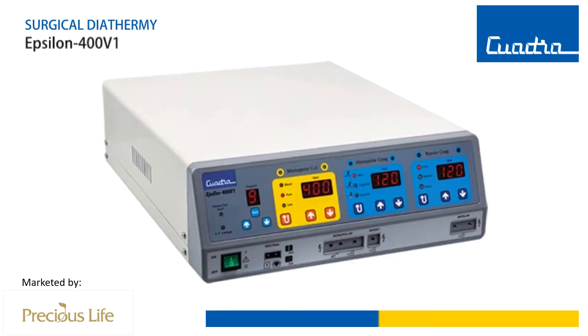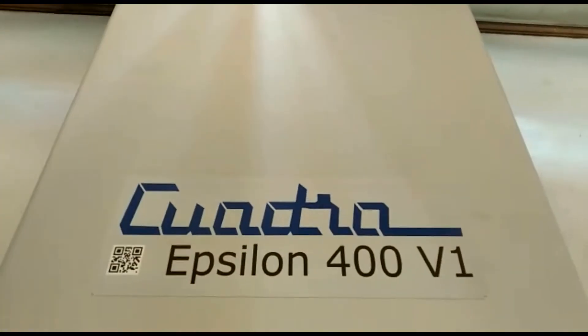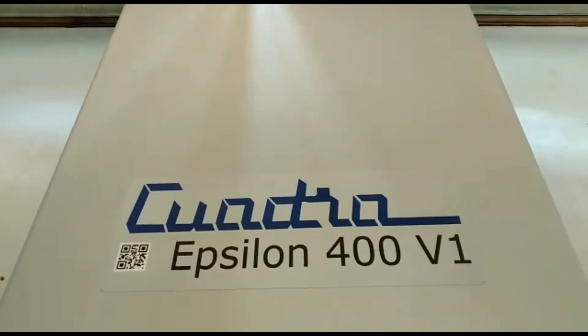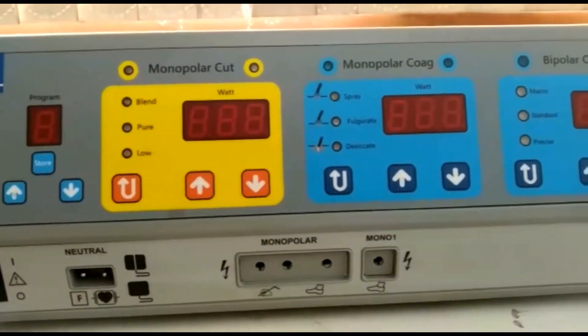In this video I'll talk about the various features of Epsilon 400 V1, the accessories, and useful tips for operating it. This is Cuadra's surgical diathermy Epsilon 400 V1, a premium diathermy with advanced features for monopolar as well as bipolar. Let's understand the front panel of the unit.